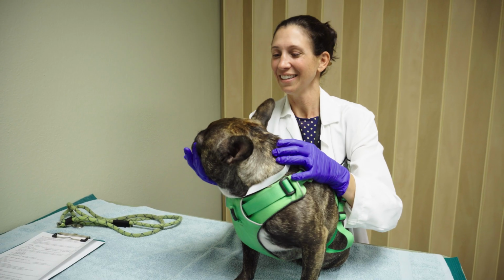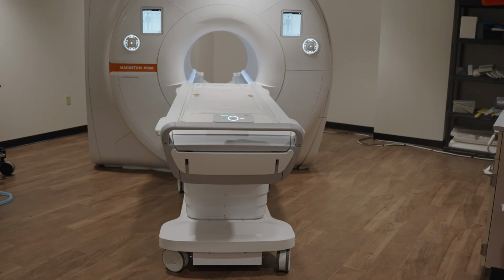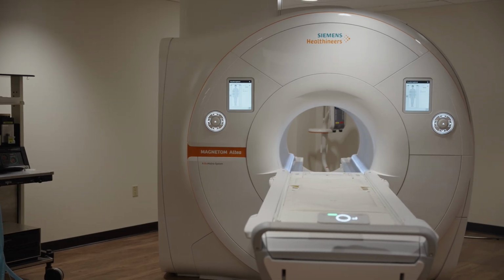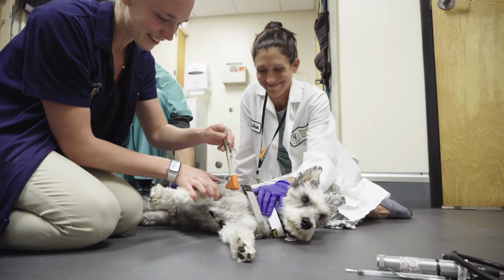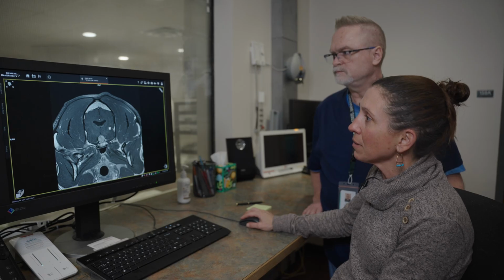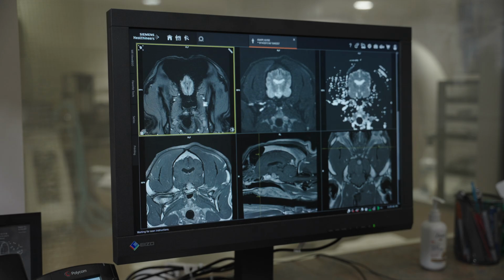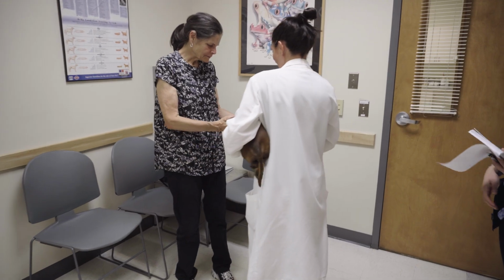My name is Stephanie McGrath, and I'm an associate professor in clinical sciences, and specifically in neurology and neurosurgery. Imaging, specifically MRI in neurology, is the most useful diagnostic tool that we have for diagnosing brain disorders, brain diseases, spinal cord disease, and it helps guide our conversations about prognosis and treatment plans. It's one of the only methods for really looking inside the brain and spinal cord. All other diagnostic tests are very limited in that capability, so the MRI is kind of the full package. It gives us everything that we need to know to understand what may be happening in an area of interest.